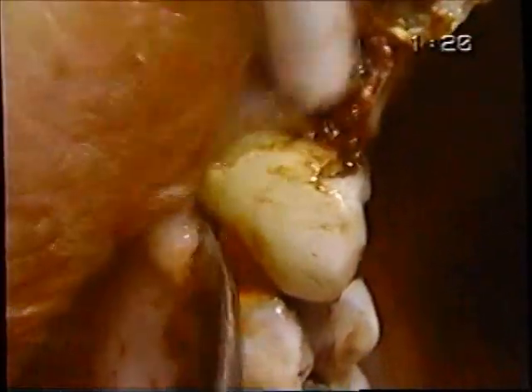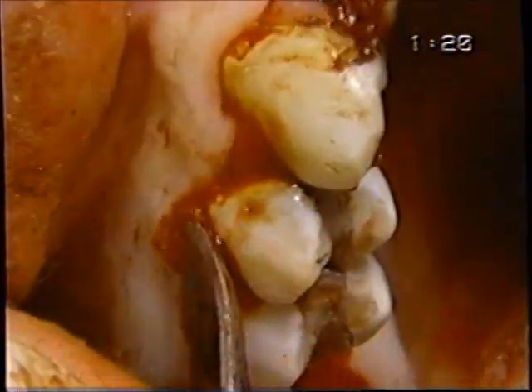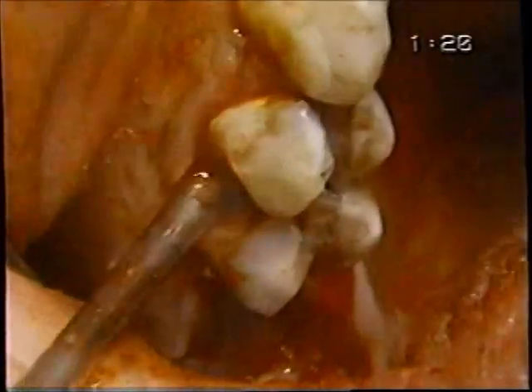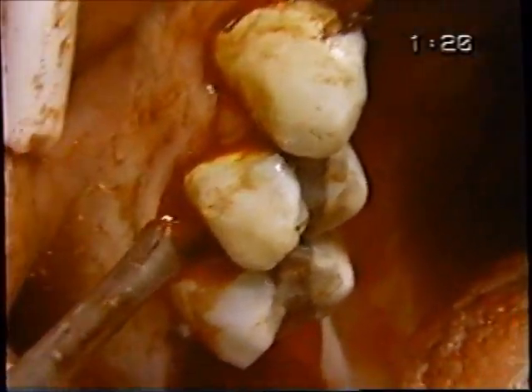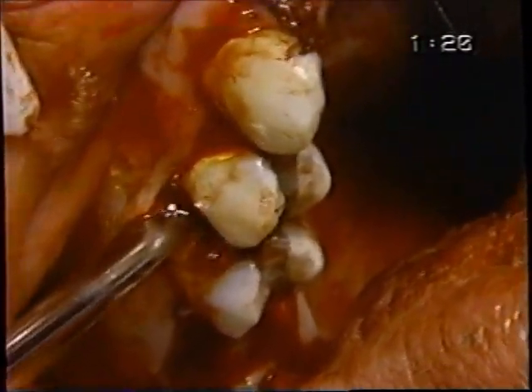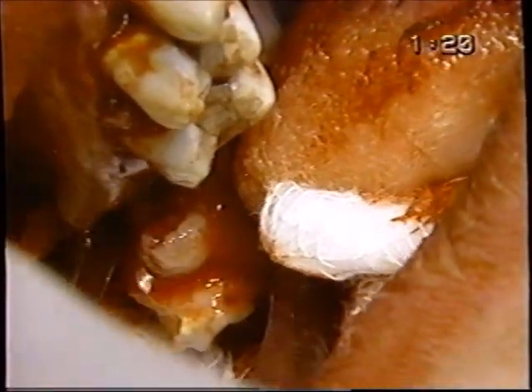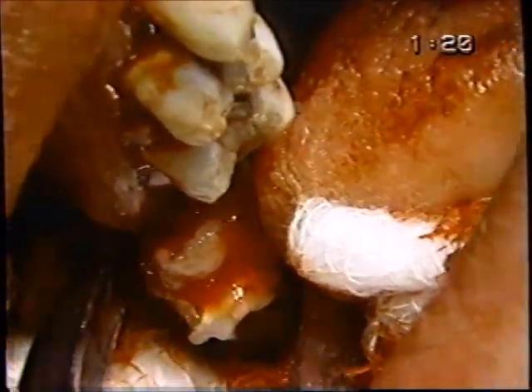You can see from looking at this Molt number 9 that it has been sharpened. I periodically will sharpen it to make sure it does this quickly and efficiently. You have to have finger rest so that if it does slip, then it doesn't go very far. Since we got a little movement with the 301, we're going to the next larger straight elevator. So the first molar is the difficult one in this quadrant. We have gauze in the back just in case this decides to slip backward, which it could easily do. It's just hard to get a grip on this. Here we go.